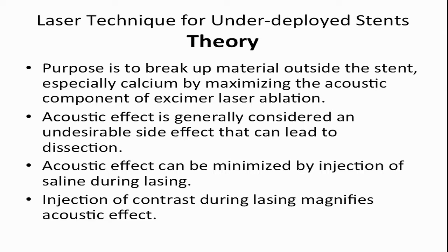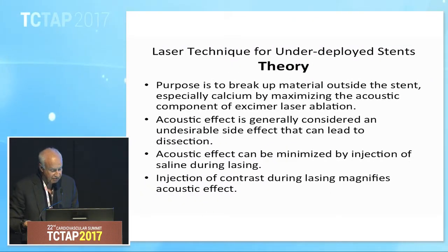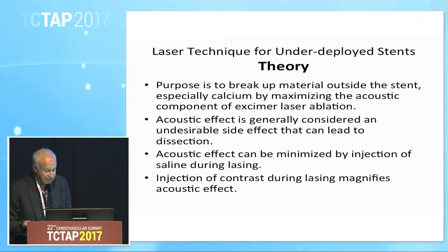using a bad side effect of excimer laser ablation, which is an acoustic effect. The acoustic effect is generally considered undesirable and can lead, and does frequently lead, to dissection. When we do normal laser angioplasty, we do everything we can to minimize the acoustic effect by the injection of saline and avoid the injection of contrast, which magnifies the acoustic effect.